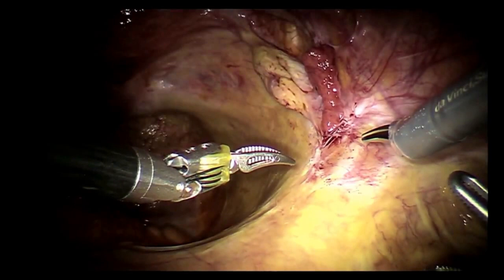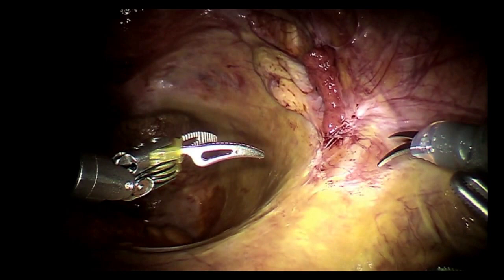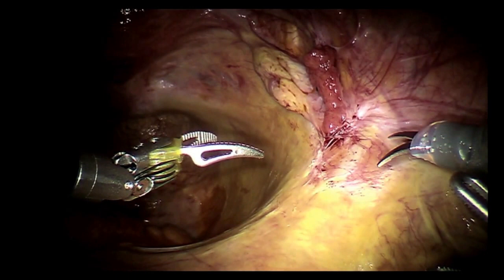Great. So let me just go over the game plan. The plan is we have put in 6 ports. The port placement is similar to a radical prostatectomy, so no different. And we are going to dissect out the external iliac artery and external iliac vein and prepare these 2 vessels for the transplant.